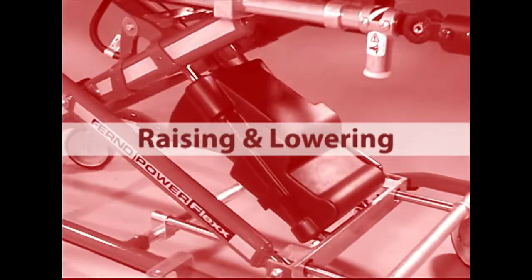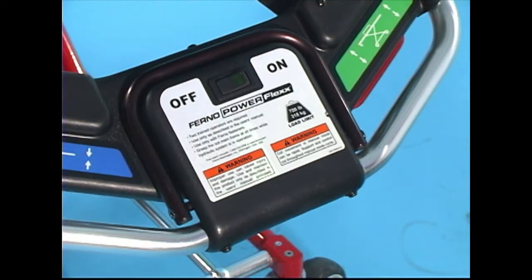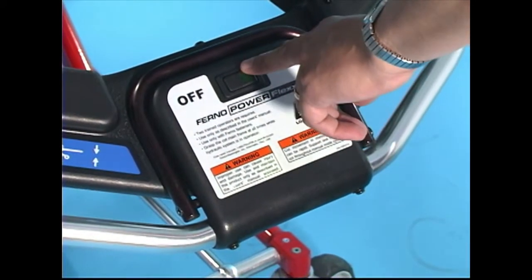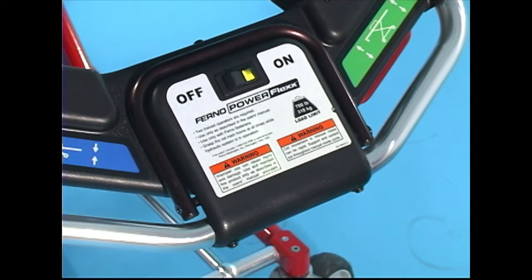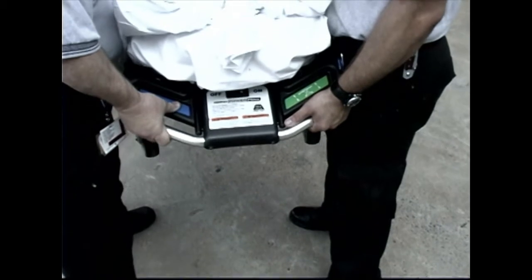Raising and lowering the cot. The main power switch for the PowerFlex is located at the center of the foot-end control panel. Turn the switch on to use the cot in its powered mode. A green light in the switch indicates the power is on. Large touch pads on the control panel operate the hydraulic power system.